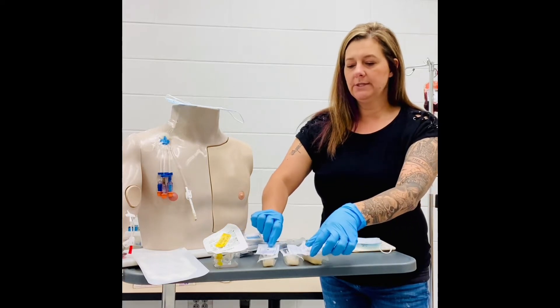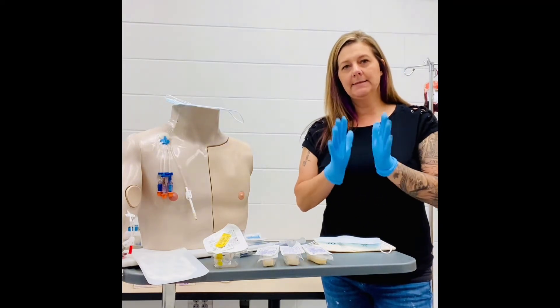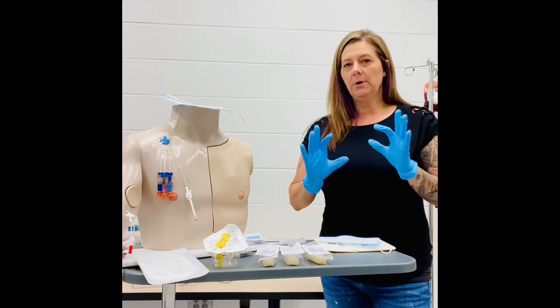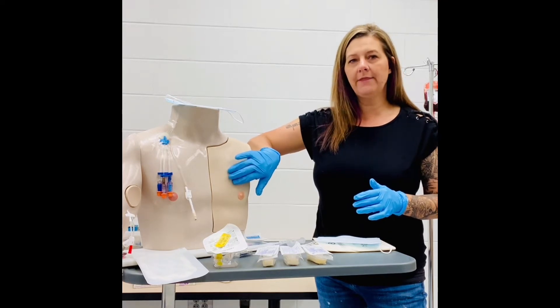To begin with, we'll want to set up all of our equipment once we've cleaned our hands. We always wash our hands, place on clean gloves, and then we're okay to begin. Once I put on these clean gloves, I want to palpate the patient's skin around the PortaCath area.